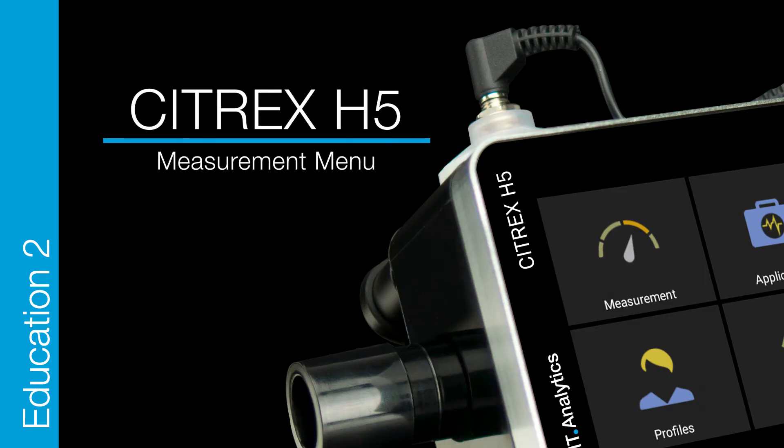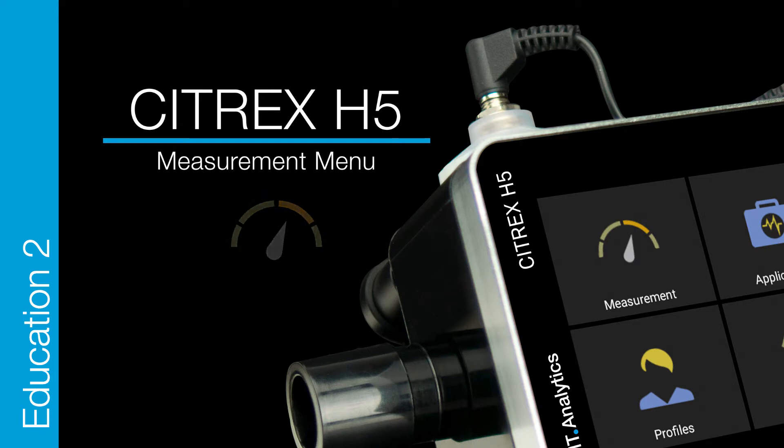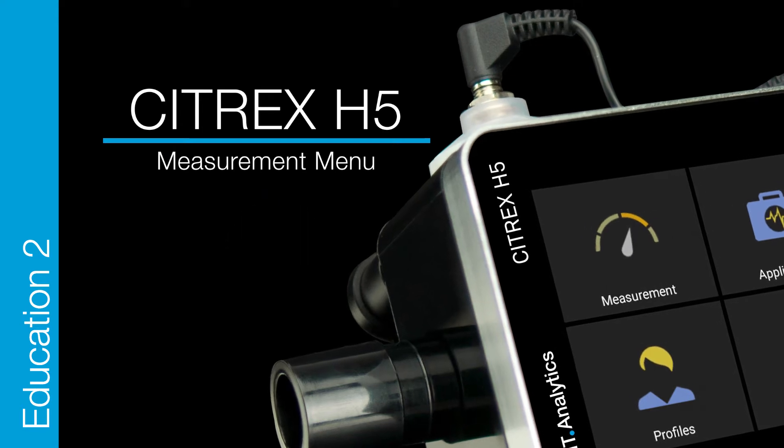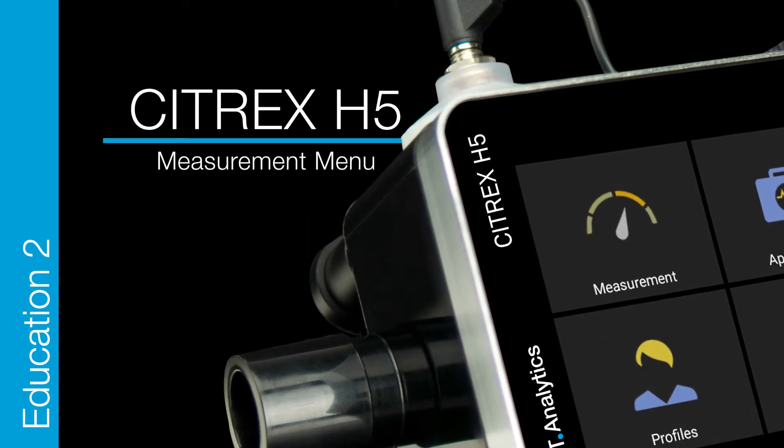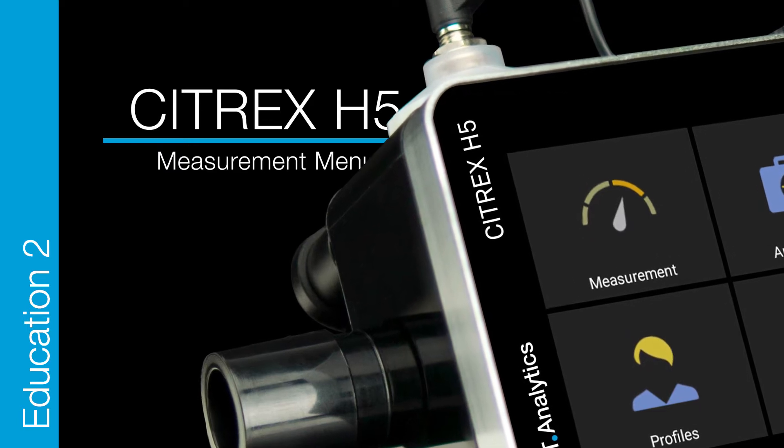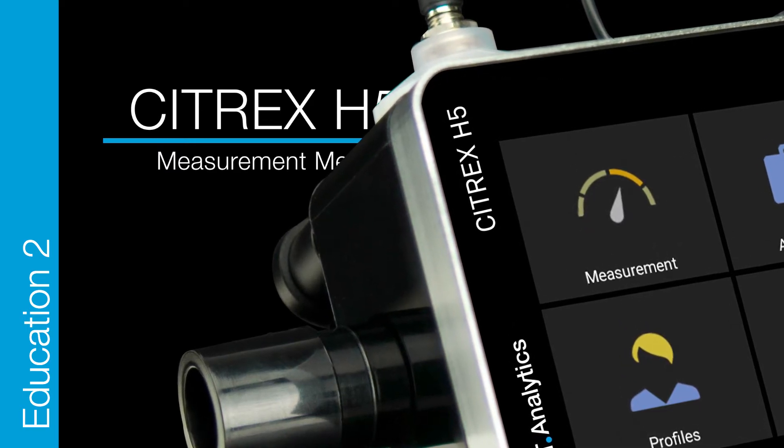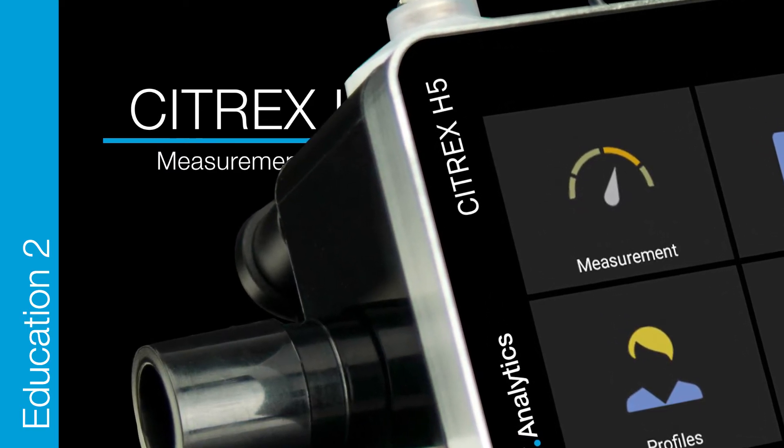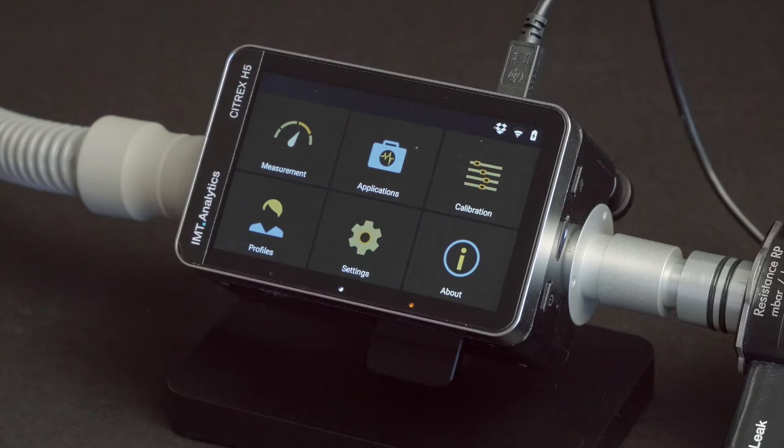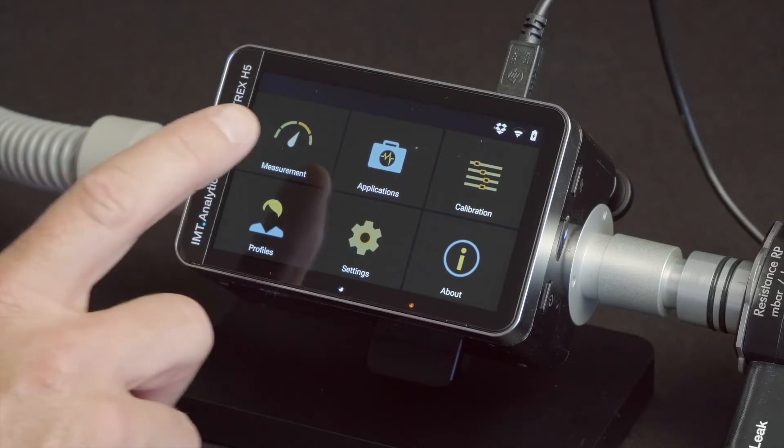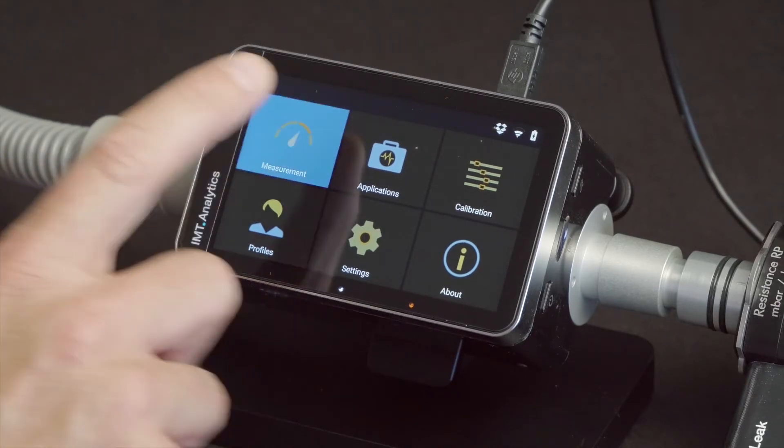Citrex H5 Education 2 Menu Measurement. Usability like a mobile phone allows you to arrange and view your measurement screens, real-time graphs, trending, and numerical parameters. Let's start. Go for measurement.